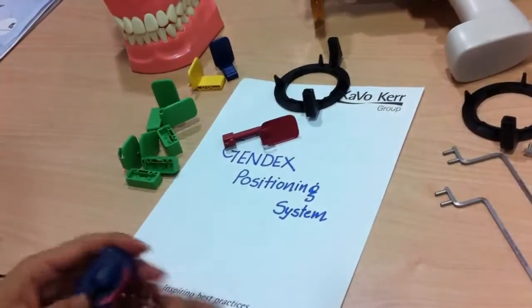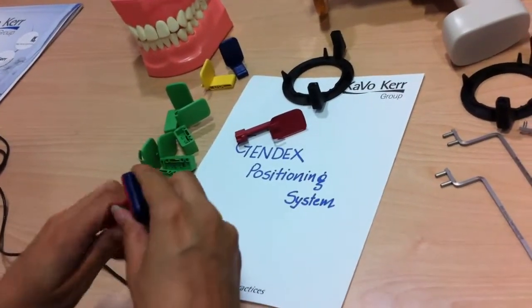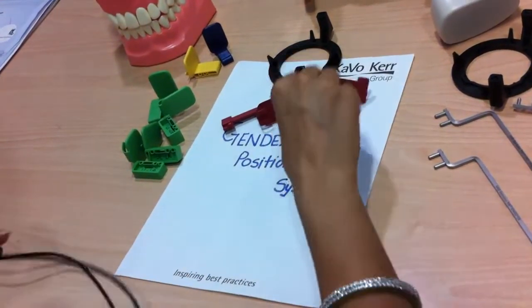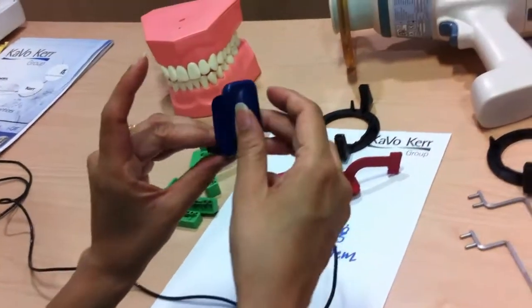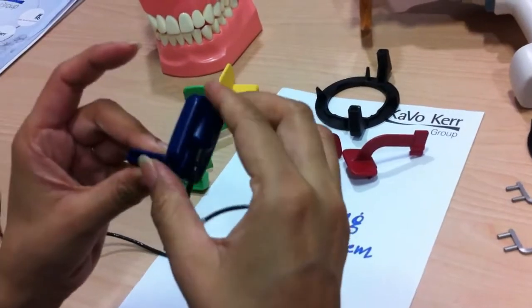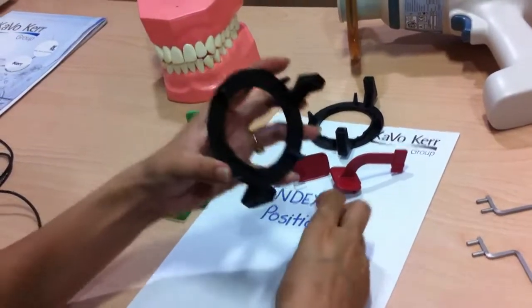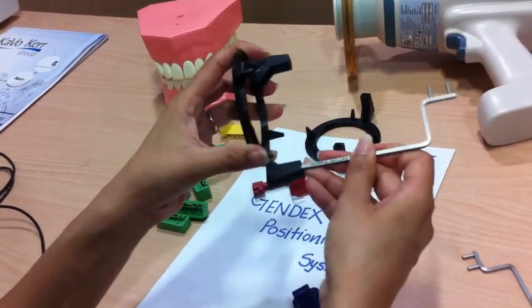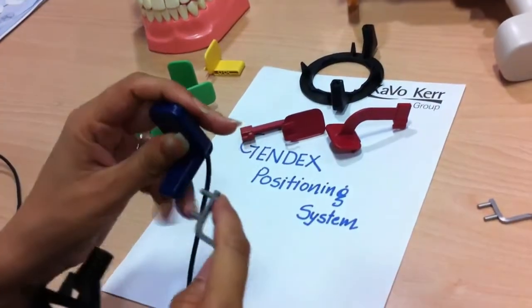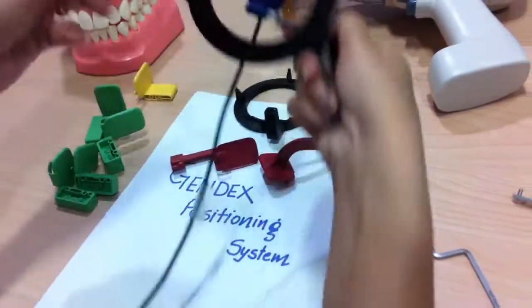Next is the anterior holder. For the anterior, we use the blue holder to hold our sensor. The rule is the same: the active area faces the flat surface. For anterior, we use the ring which has two holders and the rod for anterior scan. We insert our sensor in the slots given, and we are good to go.